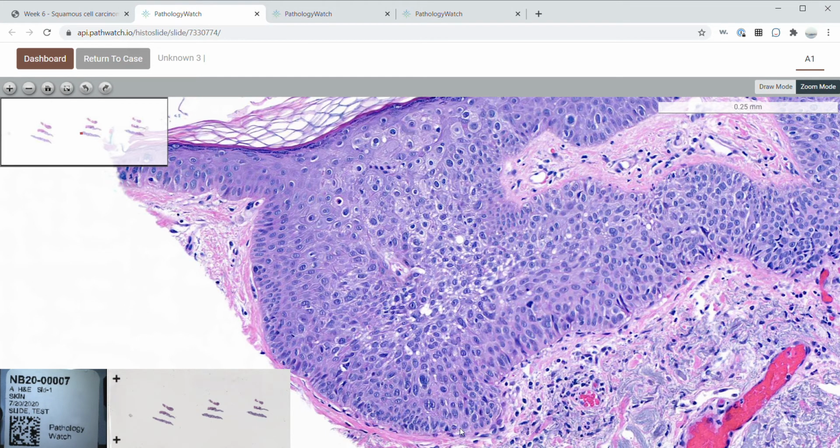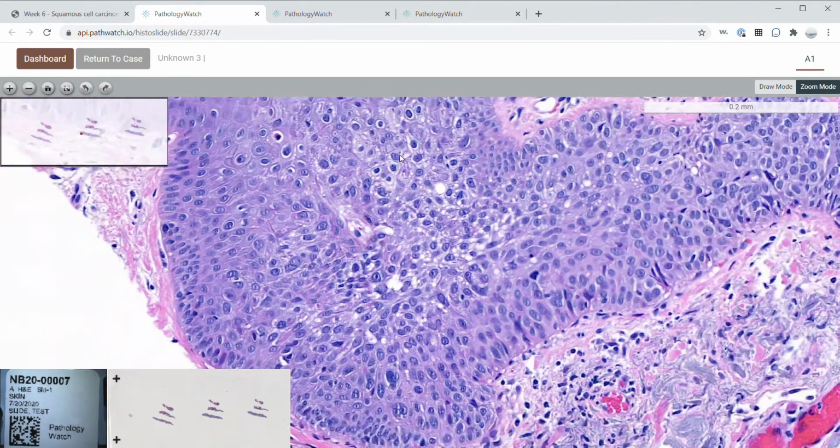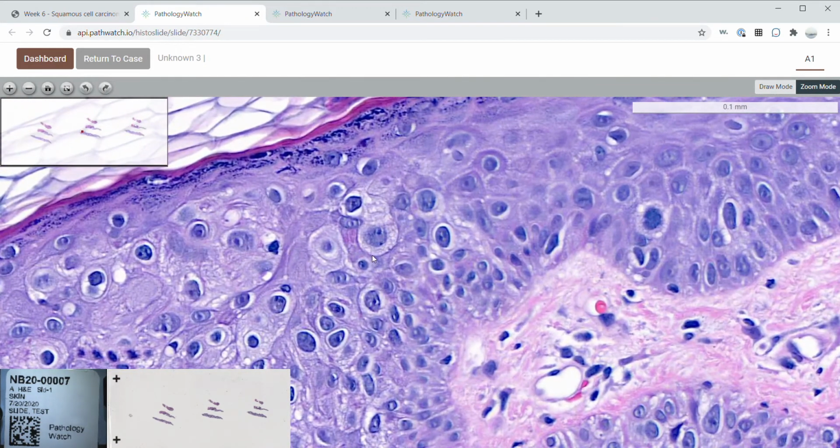You can see here full thickness keratinocytic atypia with lack of maturation as you go from the base to the top. There is increased cell density, increased nuclear size, and variation in nuclear size and shape. Sometimes in the periphery of squamous cell carcinoma in situ, you have atypical keratinocytes present as single cells that invade and involve the adjacent normal epidermis. This is known as pagetoid spread.